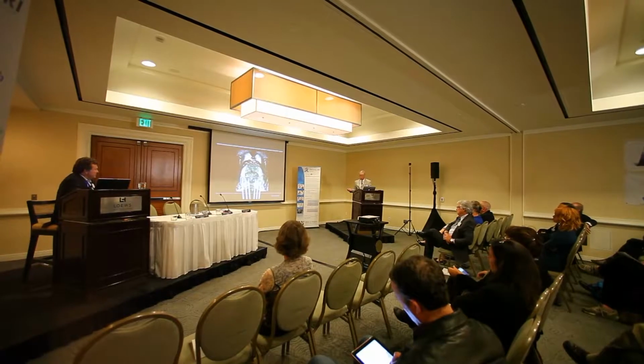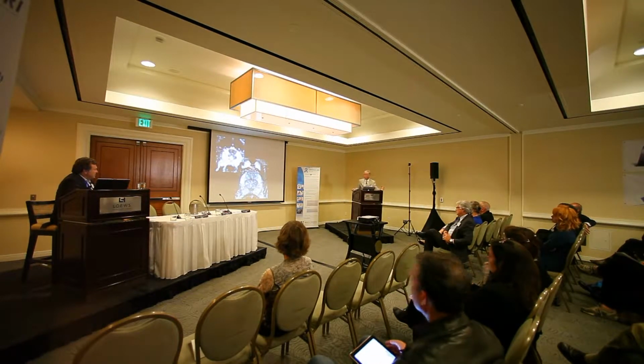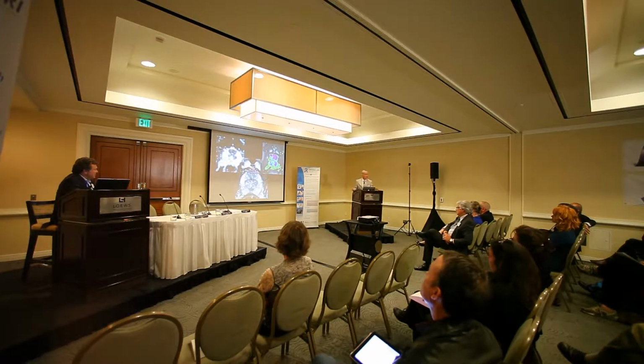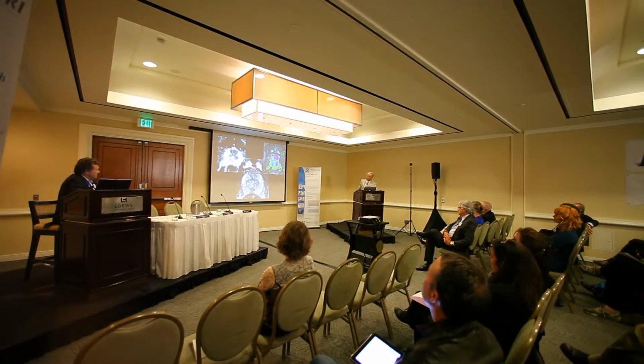Now, what about this region here? Okay, T2, it can be anything. So use other techniques. Diffusion: black. Restriction, high cell density, enhancement. So this is most probably an aggressive cancer. What to do next? Another 12 needles, transperineally, or saturation biopsy? Why not do another 50 needles? You can do that, that's for sure. Or stick in a needle deeper.